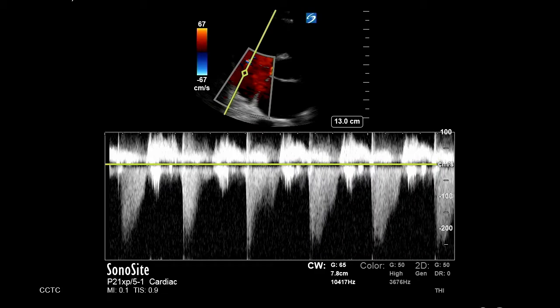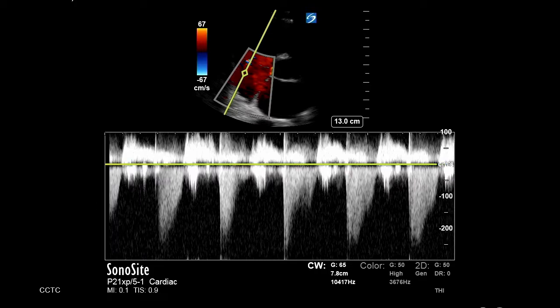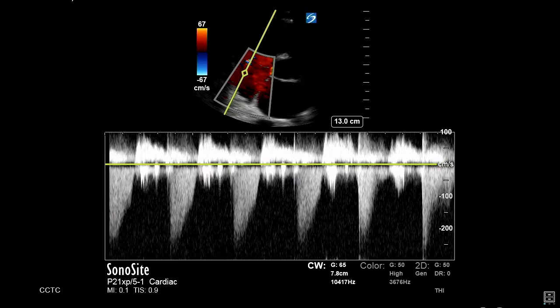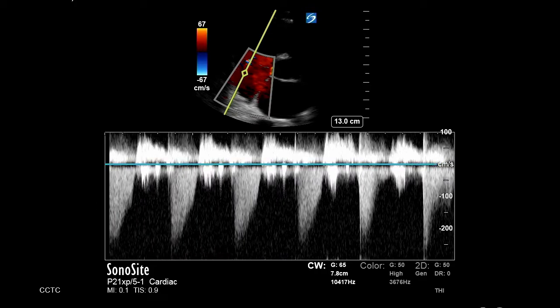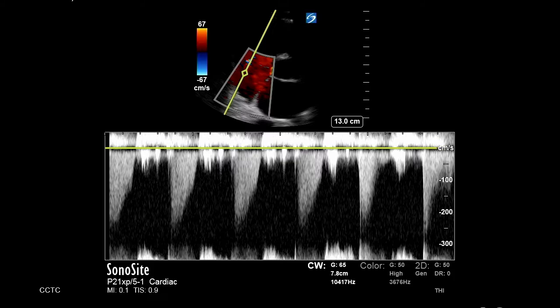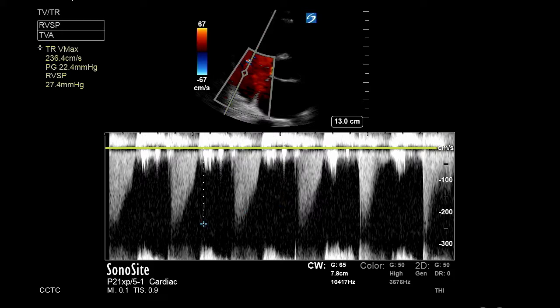When you're happy with your waveform, hit freeze, scroll back to a waveform that you're happy with, and here you can even adjust your baseline to improve your view, and now go to your calculations.